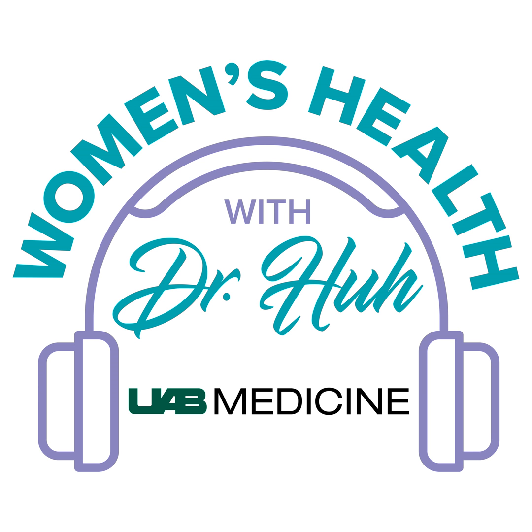Yeah, the thing I always like to impress upon people is that robotic surgery is still laparoscopy. It is a tool that enhances either the skills and ability of the surgeon or the number of patients that we can offer laparoscopic surgery to. In robotics, we use the same trocars, or small holes that we put in your abdomen, as we would for laparoscopy. However, the surgical robot has mechanical arms that attach to instruments that we use within the body.